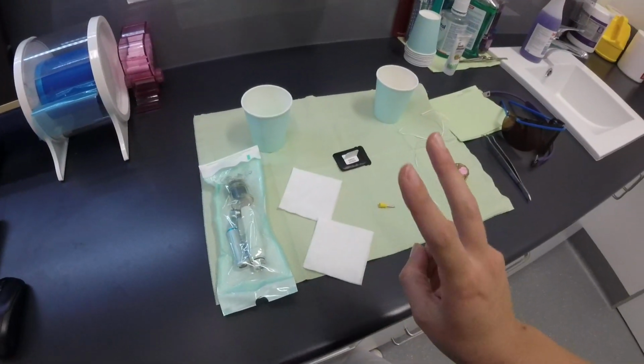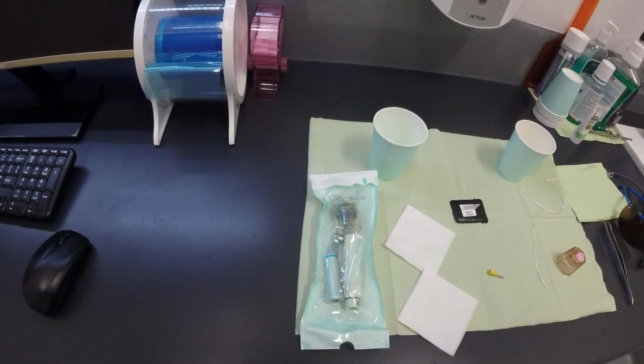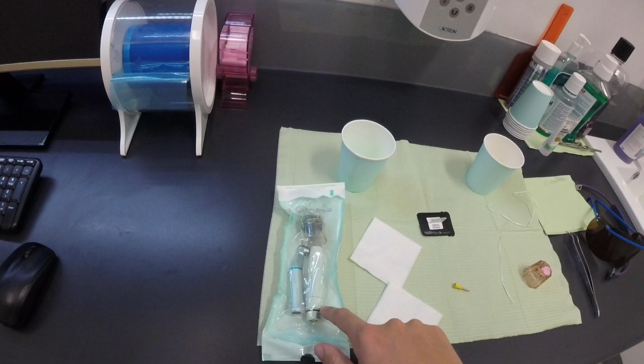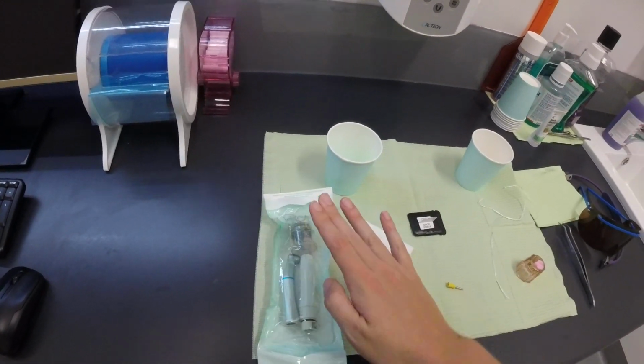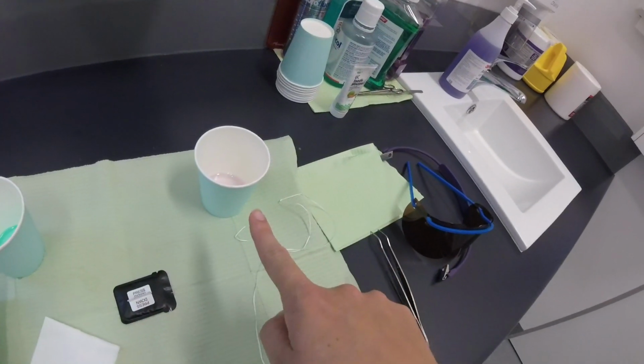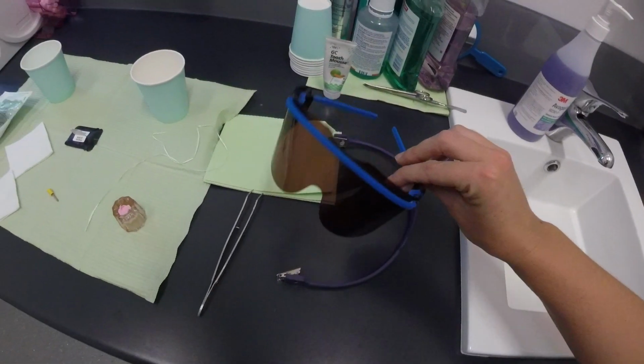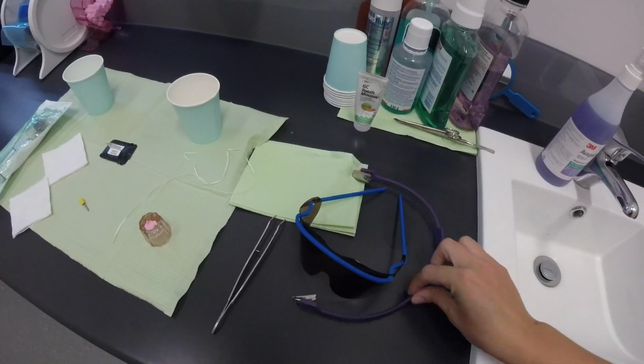We've got the gauze ×2. We have our cleaning pack with a slow speed handpiece, ultrasonic adapter, and the scaler tip head. We've got our fluoride for at the end, and our mouthwash as well. So we also have over here our patient glasses, bib, and the clip.